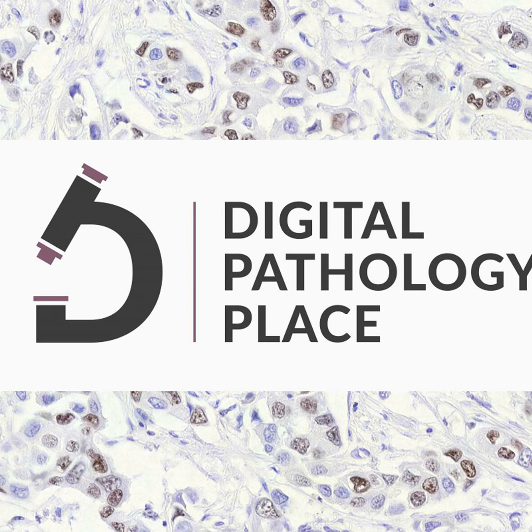One of the tools that Mark built, and that is up on his GitHub, is called Universal Stardist for QuPath. It is a plugin you can run within QuPath that runs the Stardist deep learning tool to do cell segmentation within a bright field or a fluorescence image. For explanation, Stardist is a deep learning-based pre-trained model to detect nuclei in cells. Exactly. It was trained on DAPI stained fluorescence images.